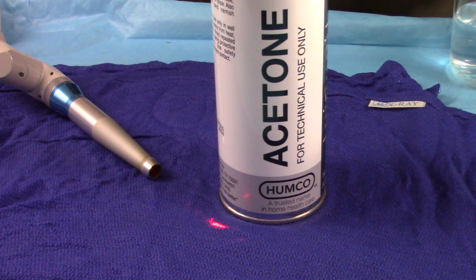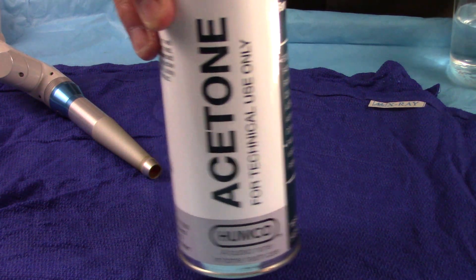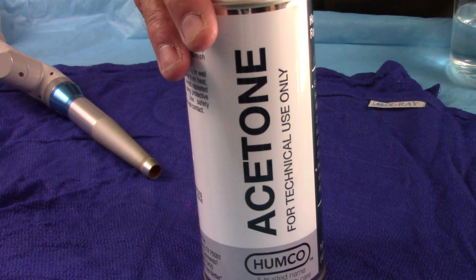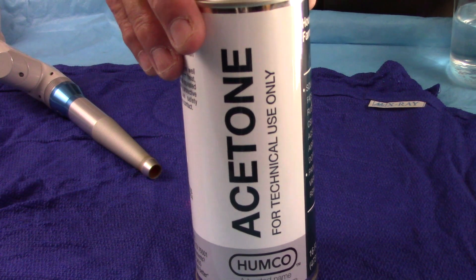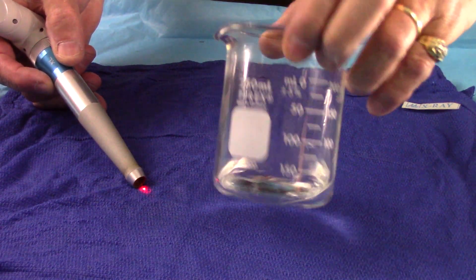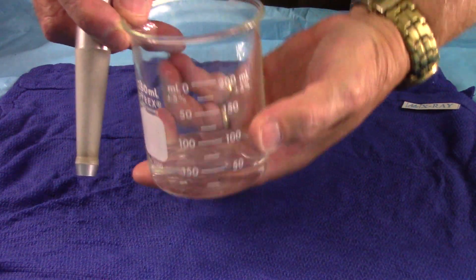Now let's try this a little bit differently. This time we're going to use highly flammable acetone. Usually in a medical surgical setting it would be a high concentration of alcohol that you'd be concerned with, but the acetone is even more flammable than the alcohol. Now I've poured the acetone into the beaker.